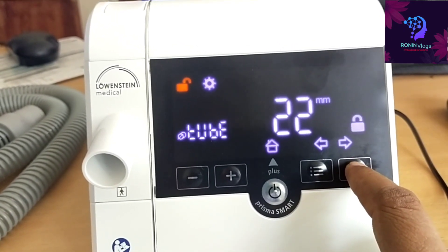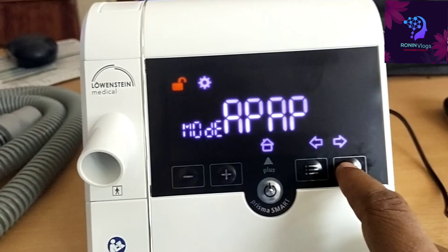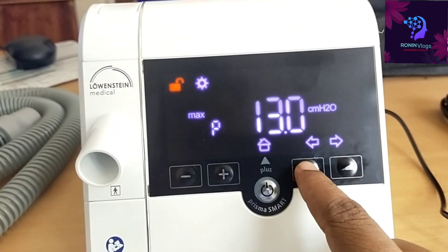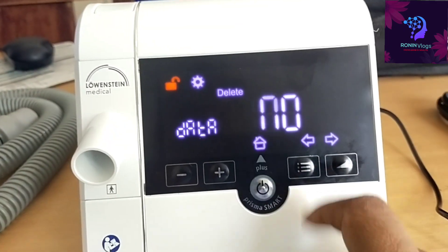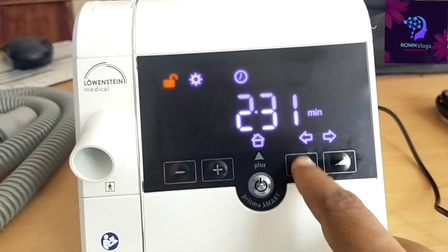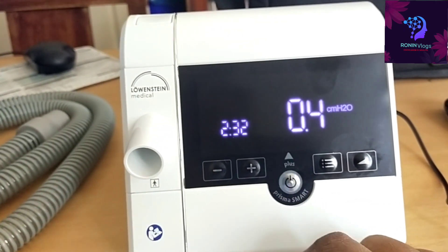Press the power button and it automatically goes to the main menu. No need to change time settings or anything else. Just press the power button to go to the main menu, then select the mode — APAP or CPAP — whichever you need. No need to change anything else; the machine is ready to start.